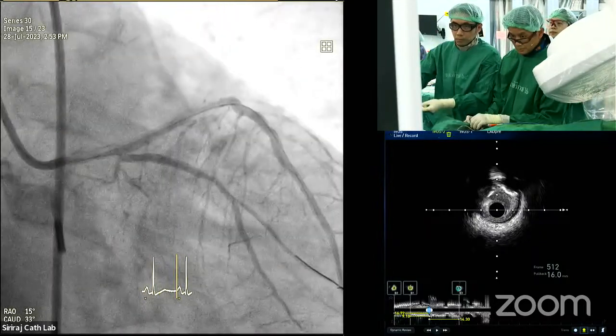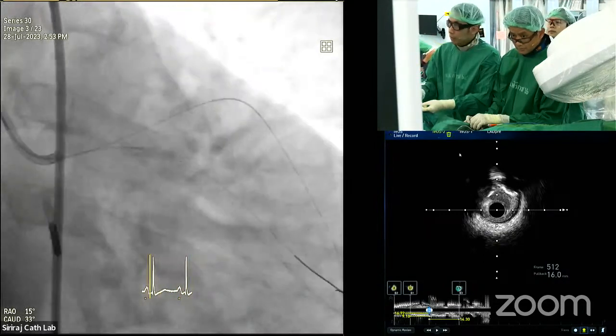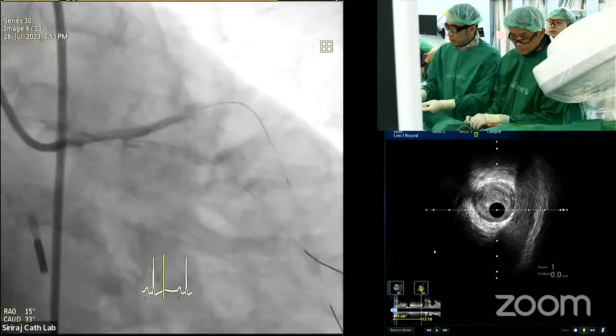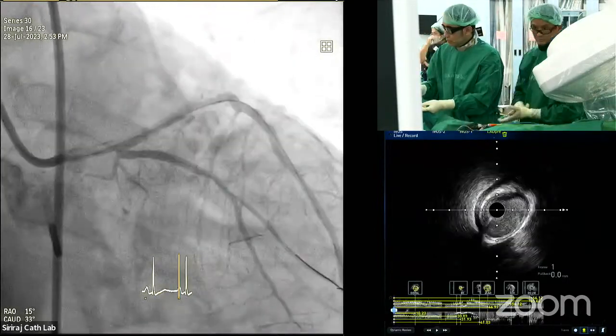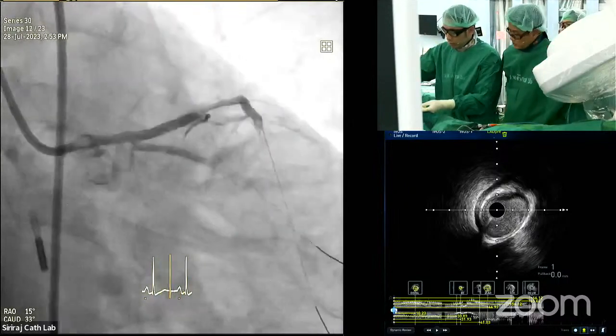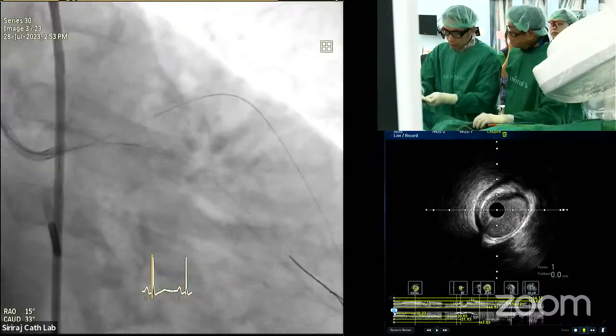So we're going to stay with you for now to watch the left main stenting and perhaps a POT before we go to the next lecture. Right, so we'll have you show us some tips and tricks here of left main ostial coverage, with your POT check like that.